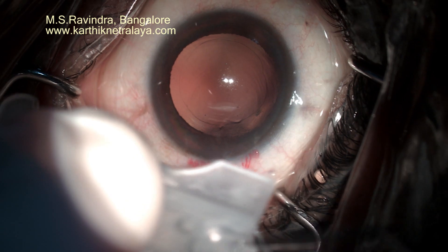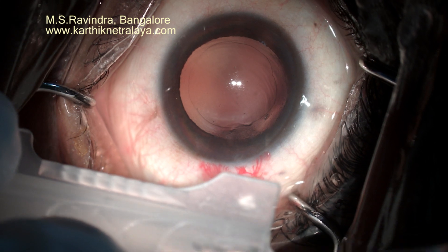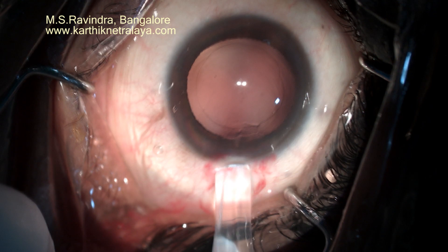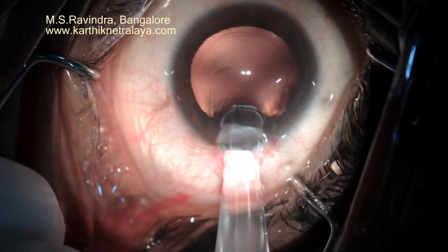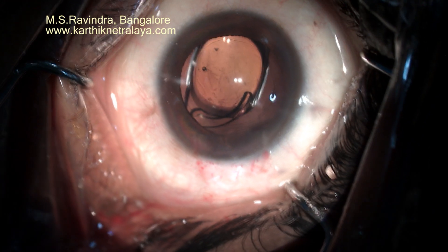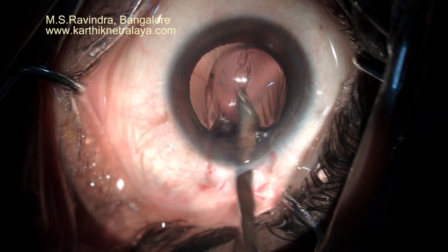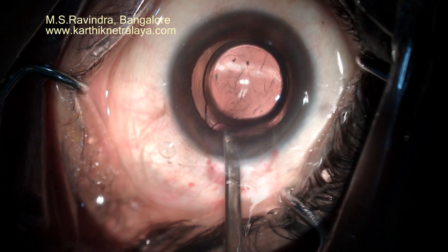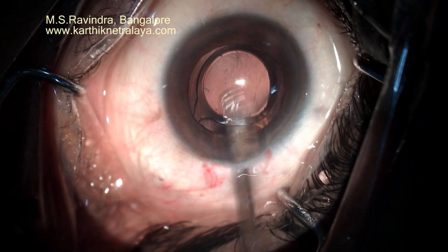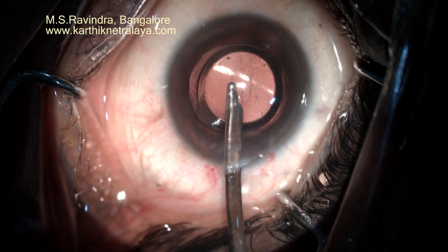An IOL is injected into a cartridge. An IOL pusher, which is a modified way of inserting the IOL, is used. Note that the cartridge is slit on the top — it opens up as the lens passes through, reducing the resistance of the lens moving through the cartridge. Viscoelastic is completely removed from the capsular bag, from the back of the lens, front of the lens, from the angle region, and from the back of the endothelium. This minimizes the postoperative pressure hike.